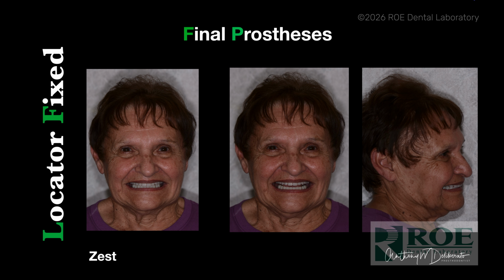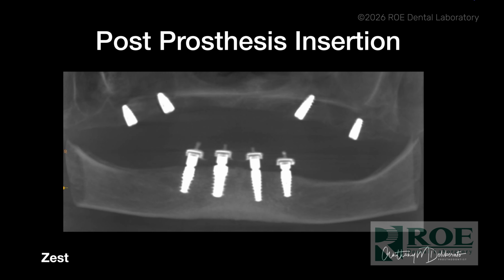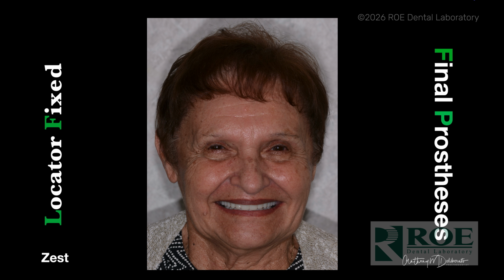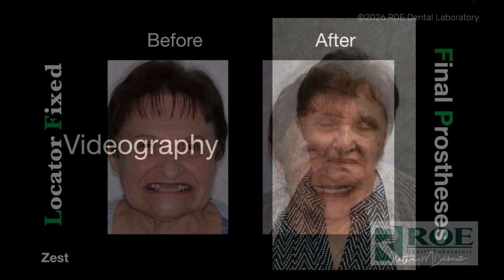And so here's our patient with their final upper denture and locator fixed lower. At some point, we're going to restore the upper implants with an overdenture prosthesis. And here's a post-op x-ray of the housings in place. The little points you see sticking up are those vent holes and the acrylic that's in those vent holes. And here's our happy patient. You can see we made those incisal edges a little bit longer than at her try-in appointment. And here's our before and after.